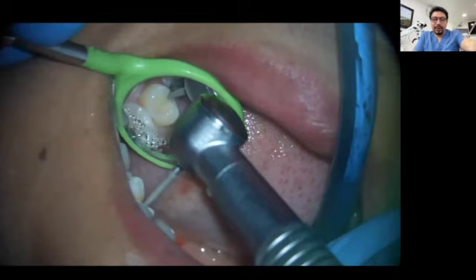One important thing when you are working under the help of the microscope is to learn where to position the mirror. One big mistake is trying to position the mirror in the same way you used to position it when working without a microscope. When you are working with a microscope, you need to place the mirror as far as possible from the working area. And a useful point of reference might be the opposite lip of the area in which you are working.